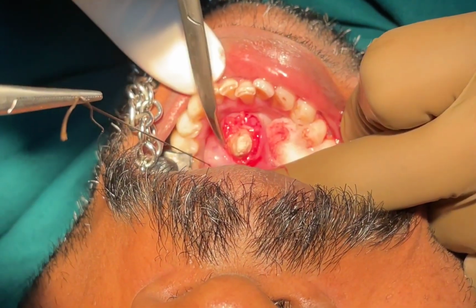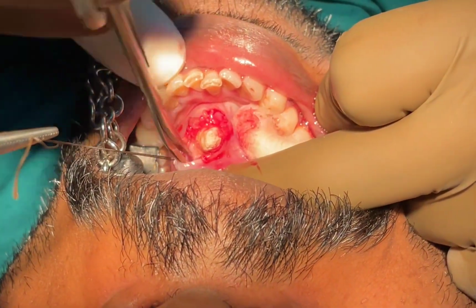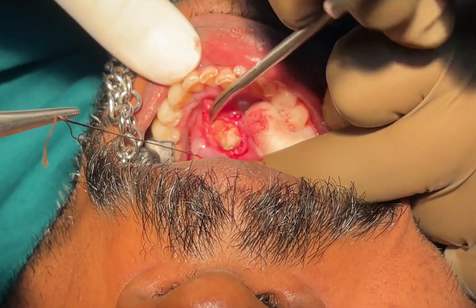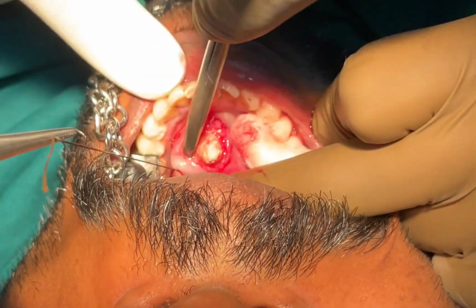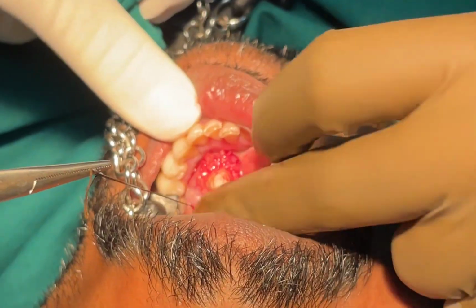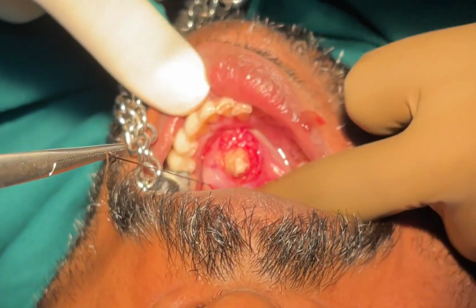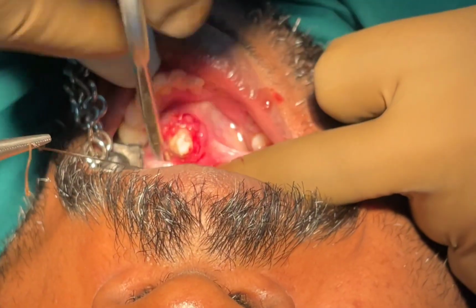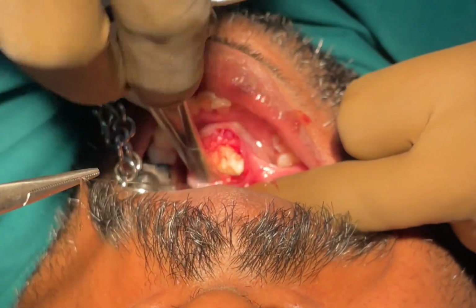You can see I'm just trying to get access to the posterior aspect of the stone and trying to push the stone anteriorly. At the same time, the stay suture is also helping keep the stone from moving posteriorly. So now the stone is again bluntly dissected with the mosquito artery forceps. Circumferentially, you are trying to free the stone.